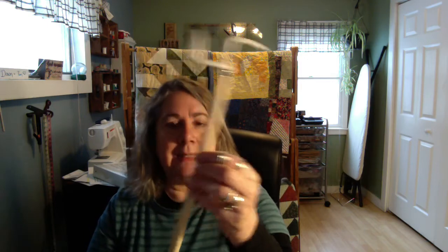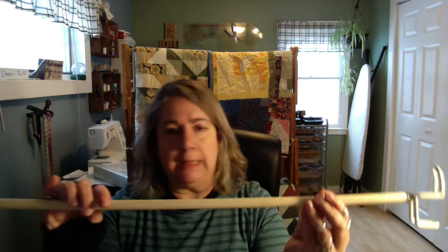This is a unique little tool. So it doesn't really have a name. I think it's just like a multi-purpose tool. But let me show you how it works for me. So remember I put that sock on before. I'm going to demonstrate on my arm because I can't really see my feet with this camera. So let's say this is my foot, got my sock on. Now I want to take it off. I've been known to use the fingers of my other foot and slide it down. What happens when I do that is that I end up cramping my toes and my foot, and it's very painful.